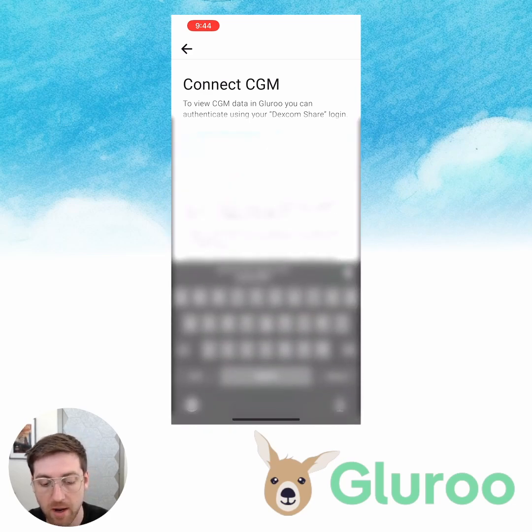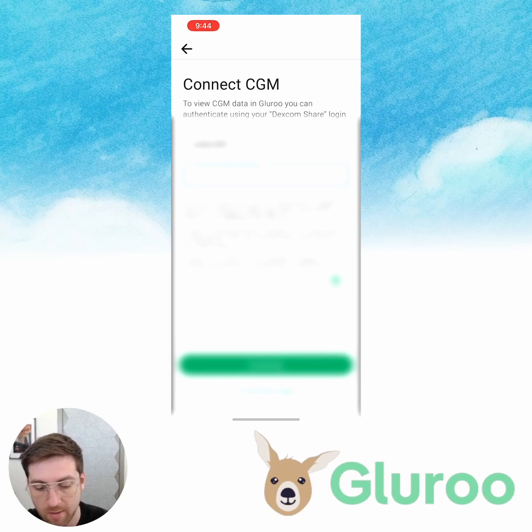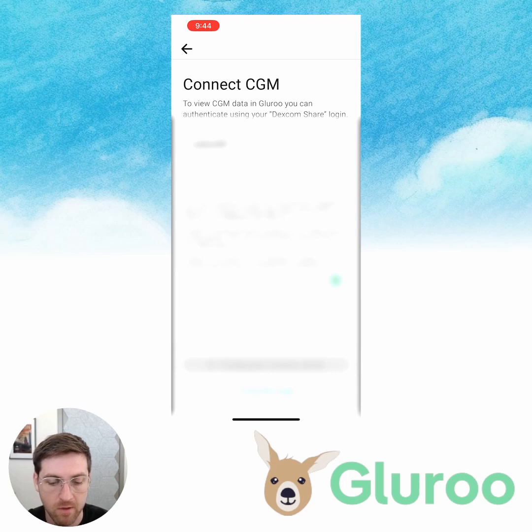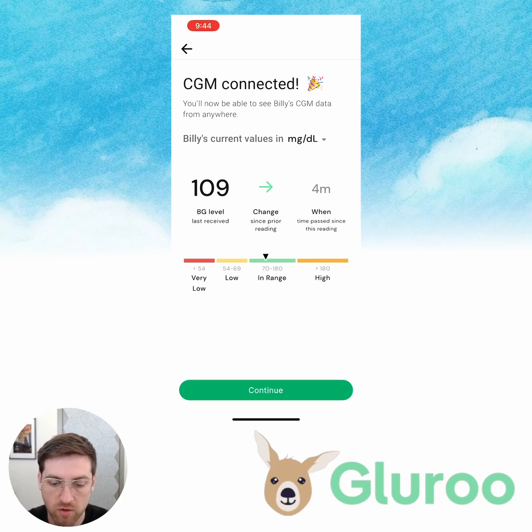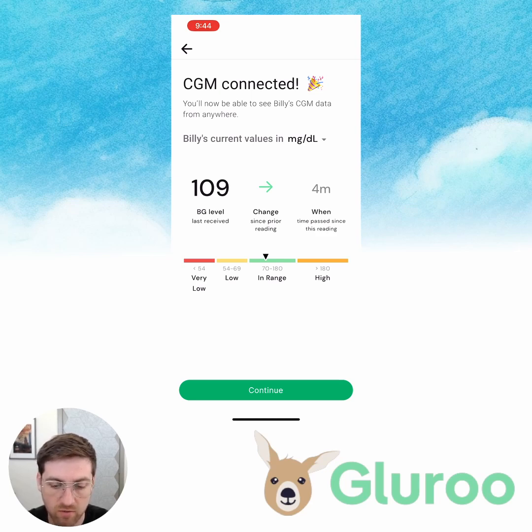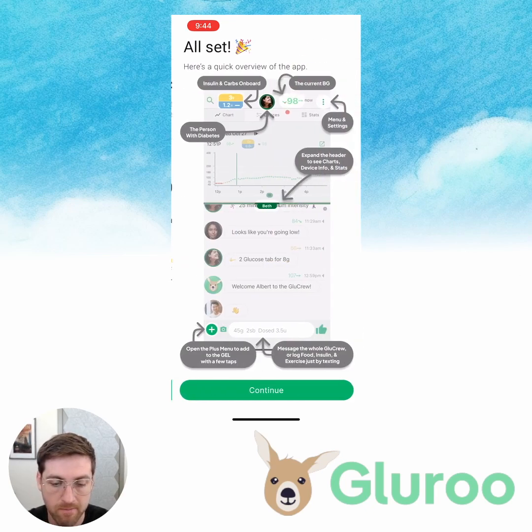I'm going to use my own personal credentials right now because I'm a type 1 diabetic as well and I am wearing a G6 on my arm. So I just tap that and it'll try to connect. And here we go — this is showing my current blood glucose level is 109. The trend arrow is steady to the right, so there's been no change or very little change since the prior reading, and the last reading occurred four minutes ago. We'll hit continue and now we're all set.